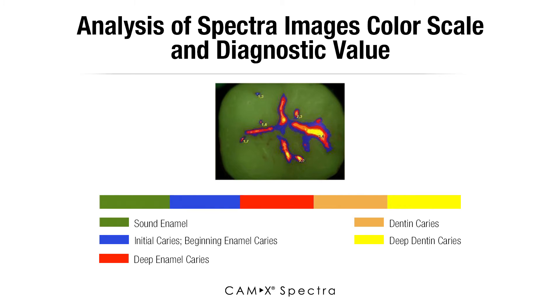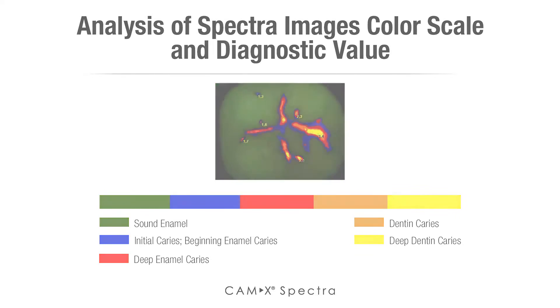Typically green is sound, healthy enamel. When we find blue in the mouth, that tells us that is the beginning of caries in enamel. As the color turns into red, that typically tells us that it has gone deep into enamel. When it gets to orange it tells us that it has gone into dentin, and yellow has gone into deep dentin.